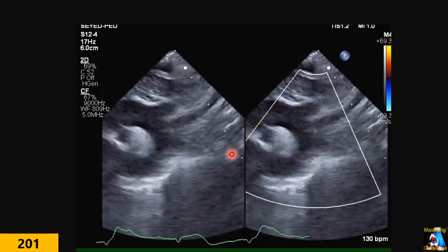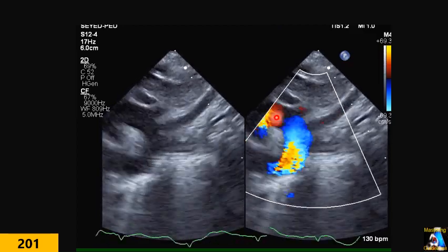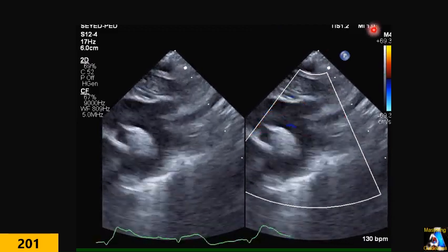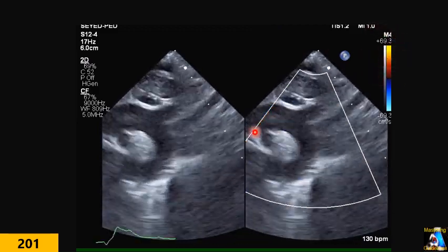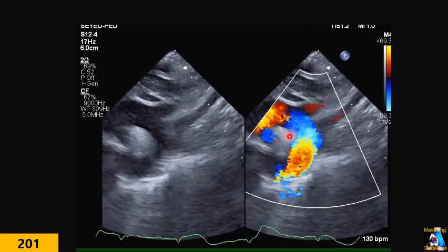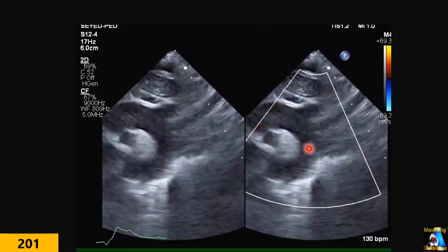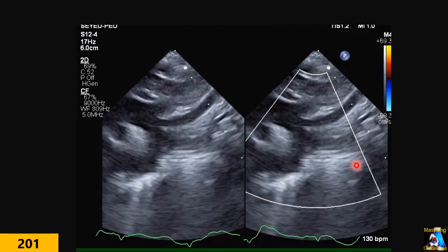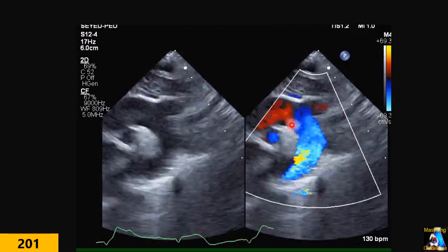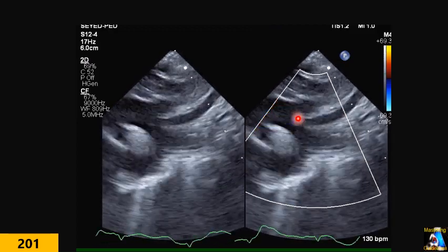Anyway, here as you can see, blood flow goes this way and this way. So at this level up to here, it is toward the transducer or against the sound wave pulse. So it goes as a positive shift. Positive shift here shows red. From here, the direction becomes 90 degrees. There is a black line between them, it suddenly changes and then becomes away from the transducer, a negative shift. So this is the Doppler shift changing. I am going to explain here, but later in more detail.